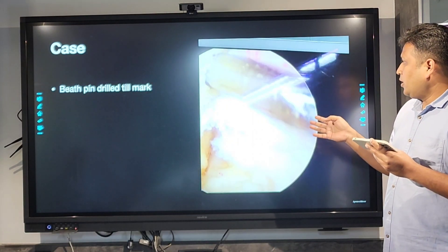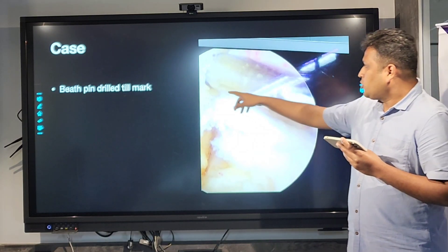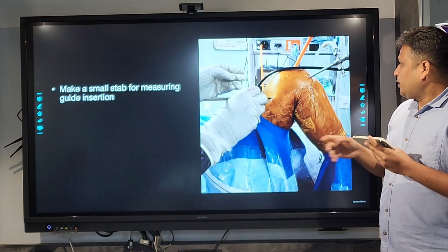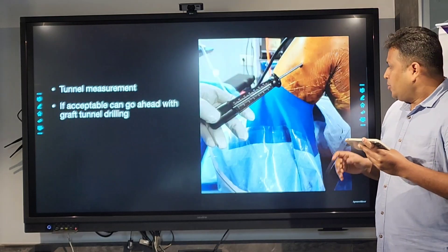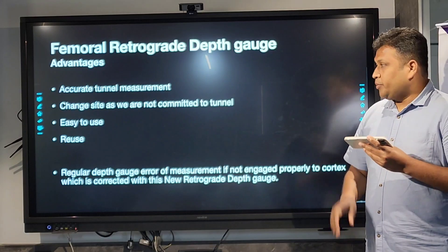This was an actual case we have done — sorry for the image, it's not very clear. You can see the mark; we inserted the pin till the mark, then made a small stab incision at the beat pin side and measured the tunnel length, which is around 42. Then you can commit to the graft drill.